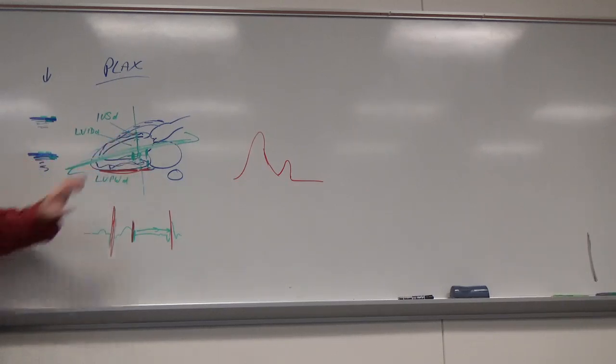Oh, and then the chamber, we're looking at about 5.5 to about 5.7 centimeters in diameter. I don't have the exact numbers in my head anymore, but when you're scanning, you'll typically have charts that you go by, and you'll get to know that really quick.